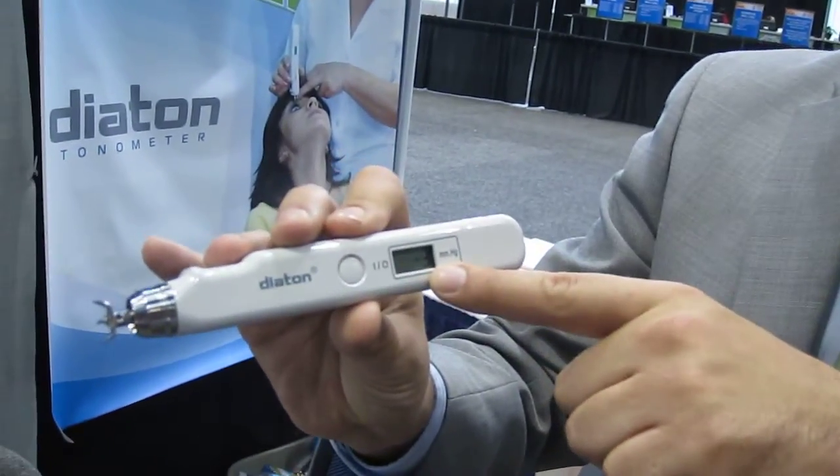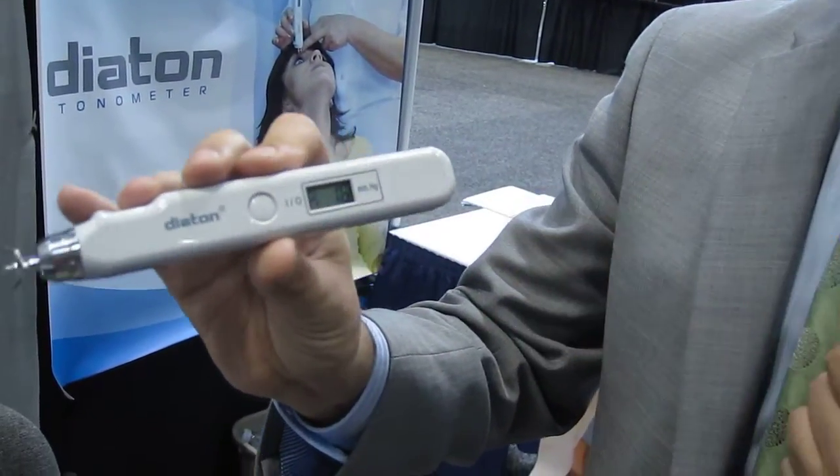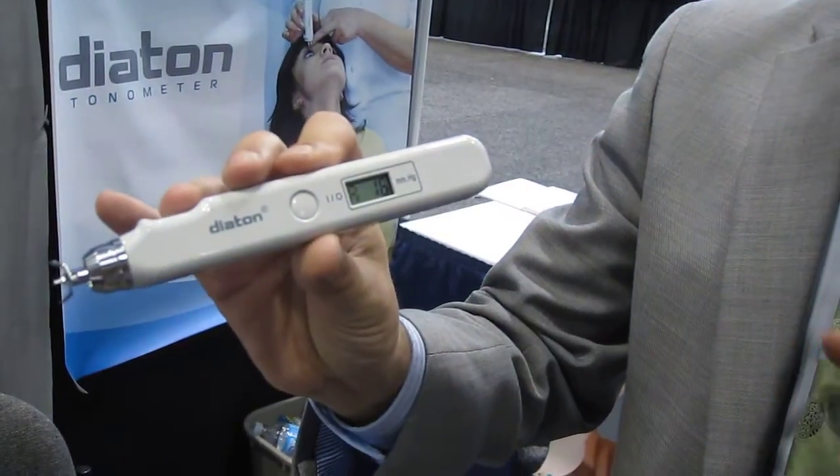Take the third reading. The device gives you a long beep. After three readings, press the center button and you get the average of the last three readings.